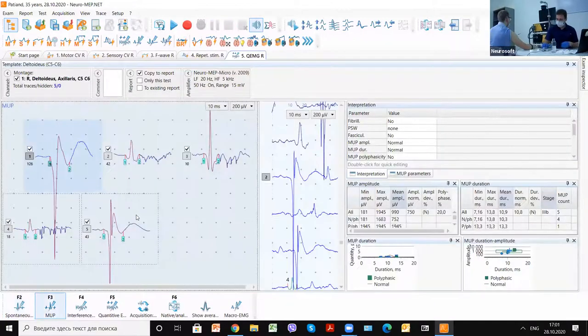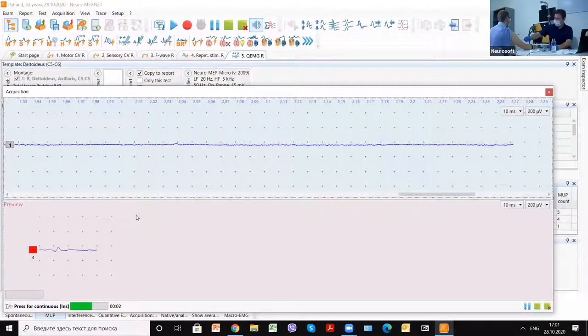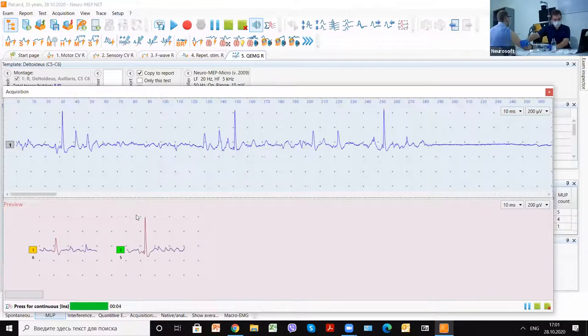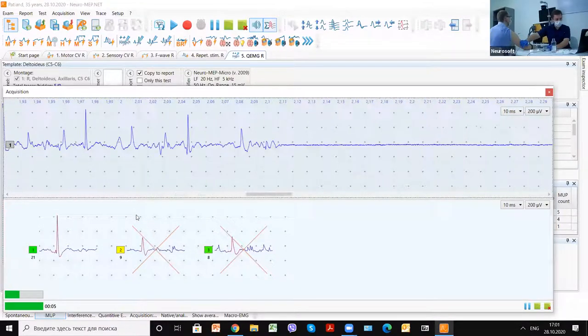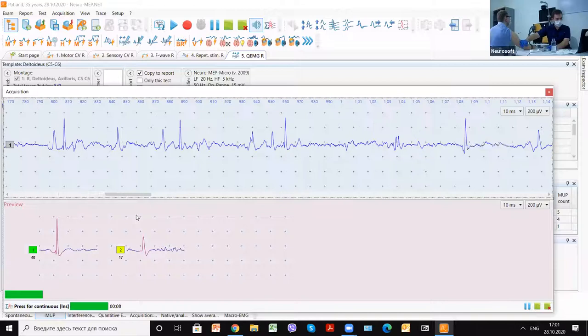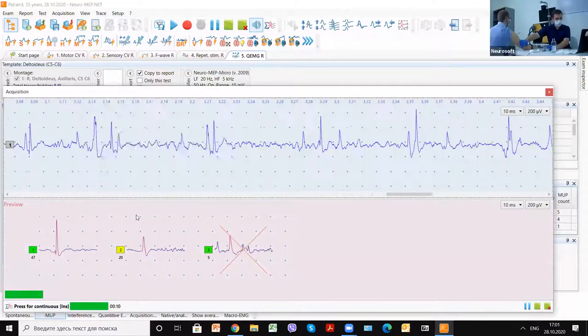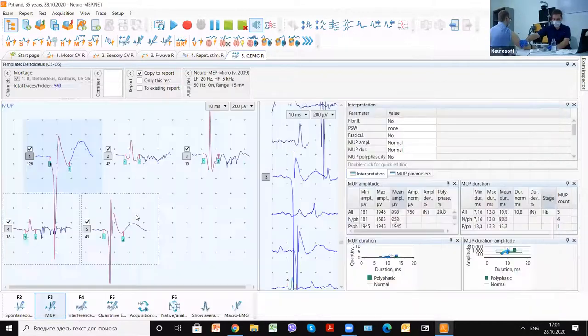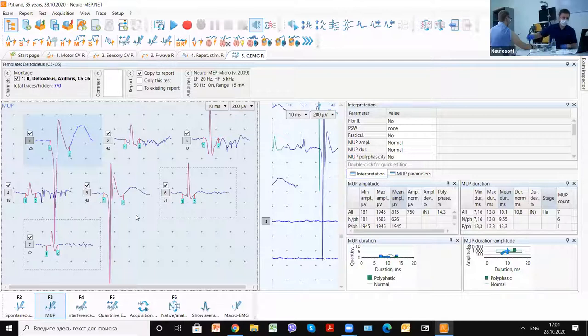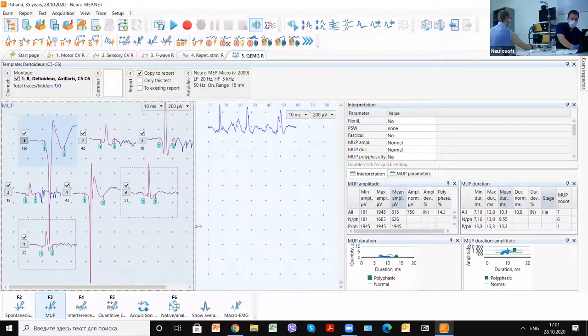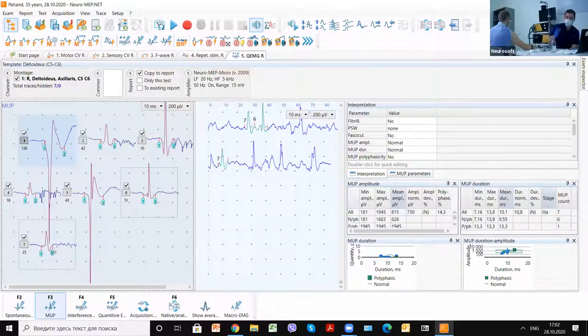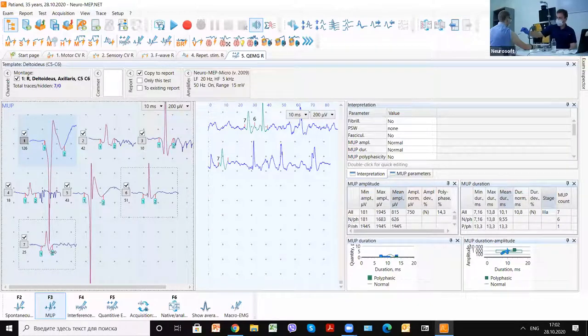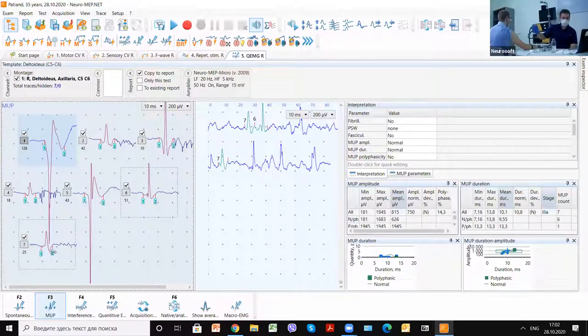And the last time we will gather motor unit potentials. We get this time seven. We should continue from that point, and it's better to use in one insertion at least five points. And it's better to use two insertions for one muscle.